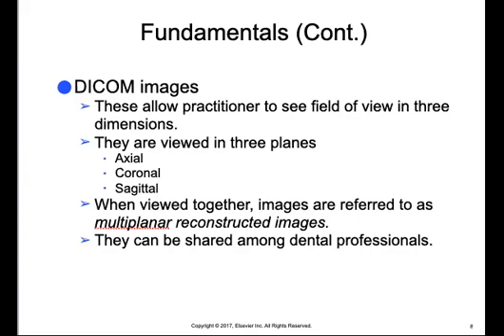DICOM images are imported into the viewing software that allows the dental practitioner to see the FOV, or field of view, in three dimensions. Once the images are imported, the data is viewed in three planes. So we'll have the axial plane, the coronal plane, and the sagittal plane.